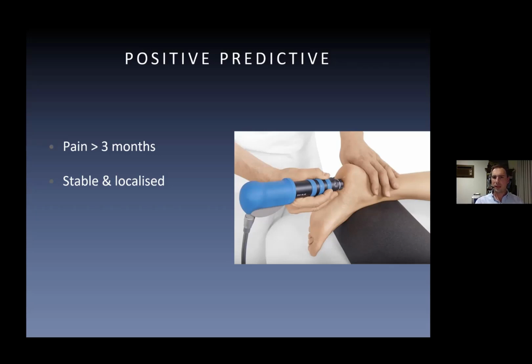You're also clinically able to localize that pain through palpation and clinical evaluation. And they should have some tolerance to palpation pressure. If they can't tolerate light palpation, then they're not ready for shockwave right now. They're not going to tolerate it enough to be able to get enough of a dose into the tissue, and that's ultimately going to affect your efficacy at the end.